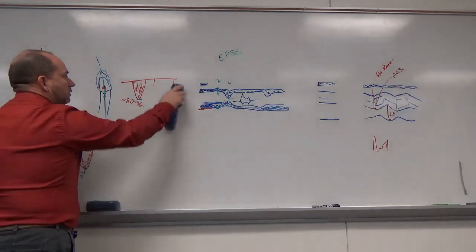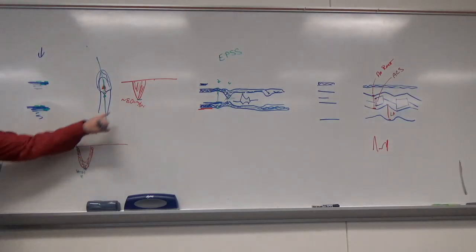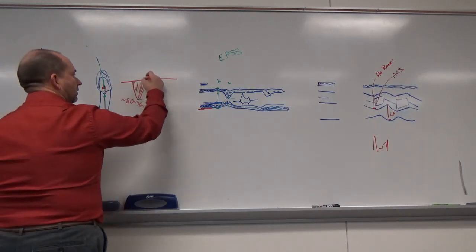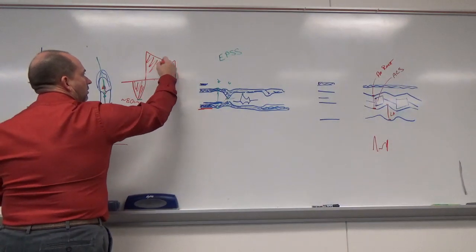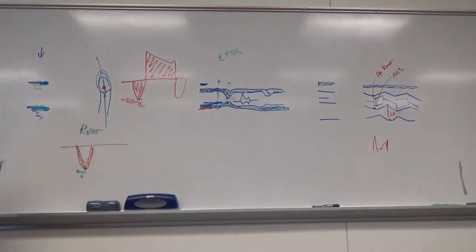Okay? And just for kicks, what does it look like on the regurgitation if I'm doing a CW through that? We are interested in the flow through the valve for this one. We're less interested in the regurgitation. But if you're going to see it, it's going to be like this. It's going to be a higher velocity. So it's just a leakiness coming back. It kind of goes up and then it goes kind of trapezoid almost and then drops back down.